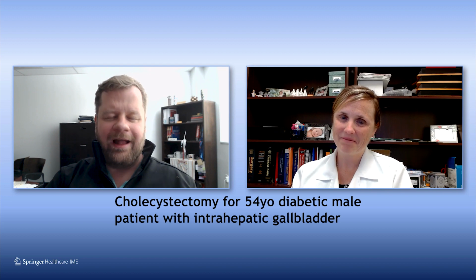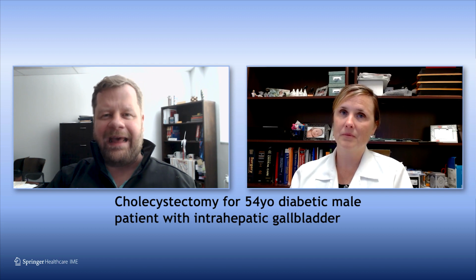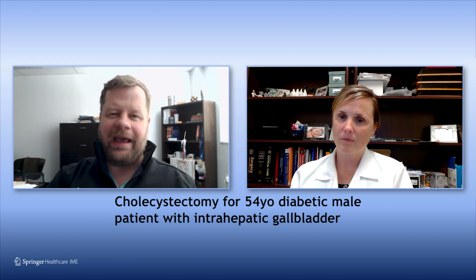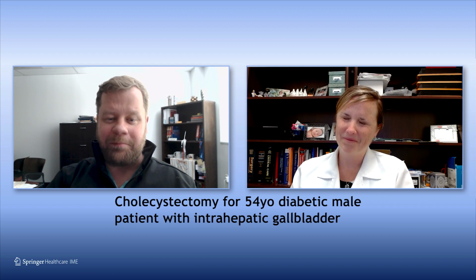I would say there are elements to the ideal situation in what we do, but in reality, what I feel like happens is we've got some annoying ooze, so we try the cautery. And then there's another spot of ooze, and then the person holding up the liver causes a little crack at the top because they're grabbing too hard, and then you have to control more bleeding. And then you maybe put the Surgicel down and then pat the liver and then lift it up, and there's still ooze. So you take that out, and then you try to put the flowable in, for example, and lay that down. But then you irrigate, and now you're washing the flowable away because you didn't plan well. And now you've got to put more flowable in to stop that ooze. And you lift up again, and it's matted, and you've got to spread it out, and it's getting clumpy and clotty. But then luckily everything is stopped, and everything looks good, and you close up anyway.